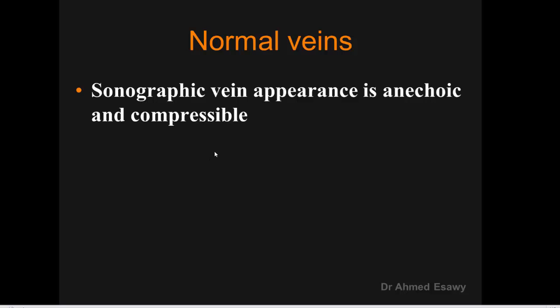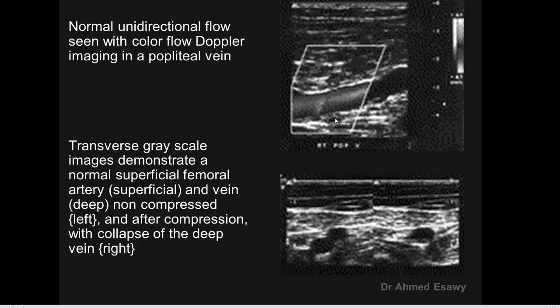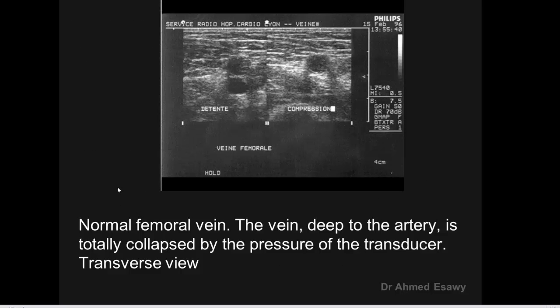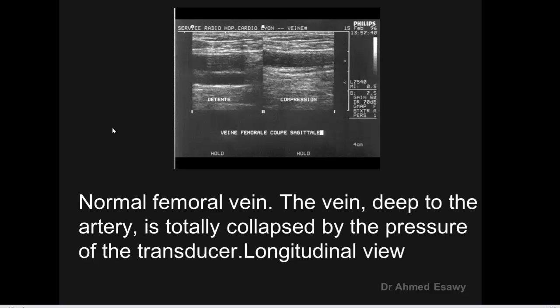Normal veins are anechoic and compressible in B-mode. Normal unidirectional flow demonstrated with color flow imaging. Transverse gray scale shows normal superficial femoral vein — uncompressed and after compression showing collapse. Normal common femoral vein: common femoral, superficial femoral, and deep femoral artery are identified. On compression, we find complete collapse by pressure — this is normal.